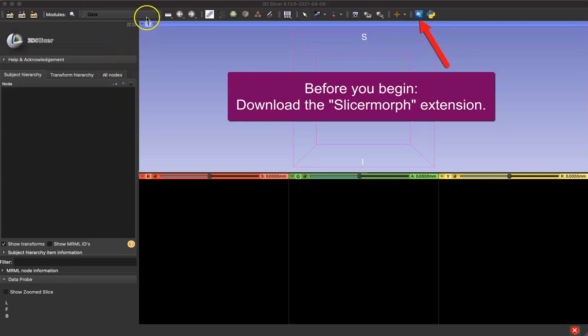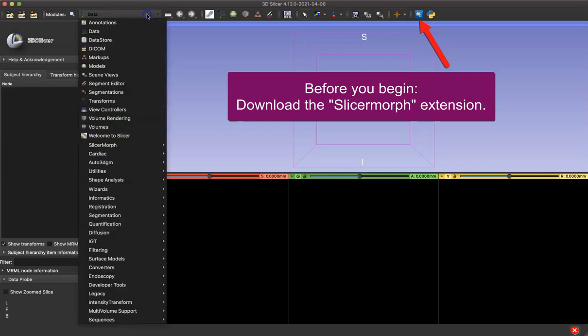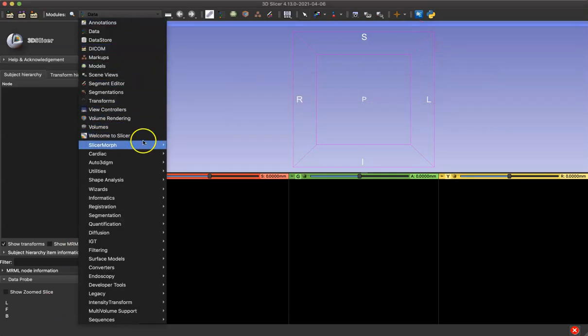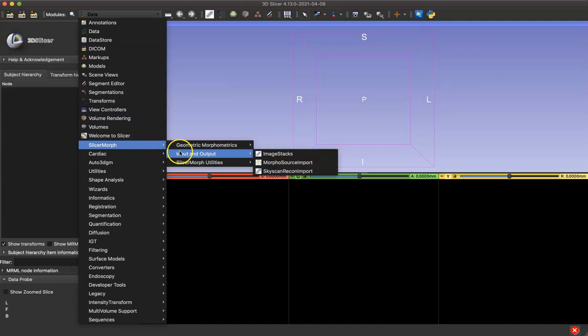Once you have SlicerMorph installed, you want to go to the dropdown menu, hover over SlicerMorph, hover over Input and Output, and select Image Stacks.